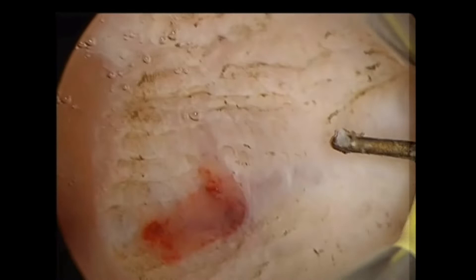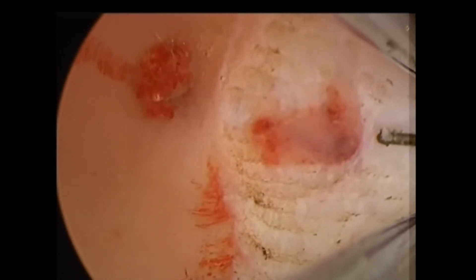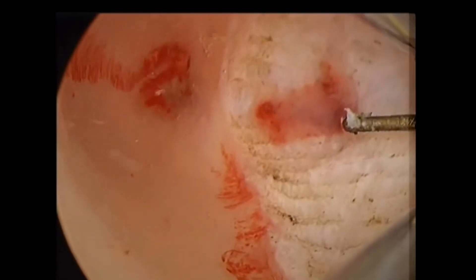Just when you cut the fibers, they retract — as you can nicely see in this view. Please rewind and observe again how, when you move the electrode and just touch the tissue, you can clearly see the tissues retracting anteriorly and posteriorly.